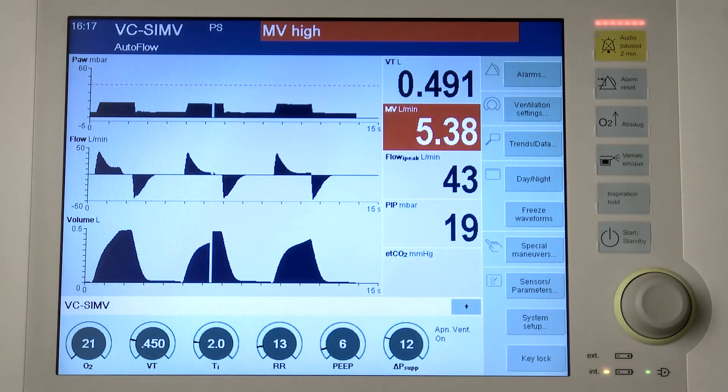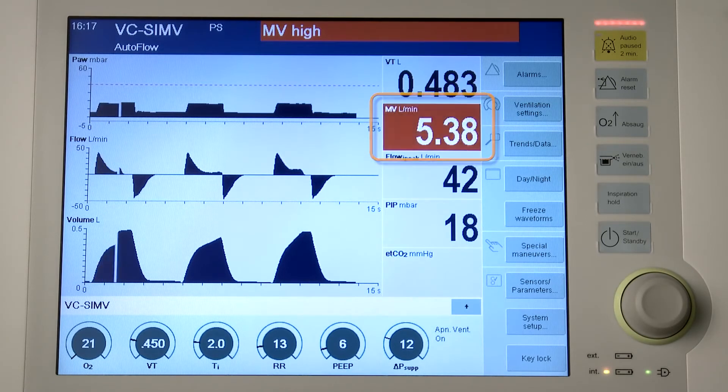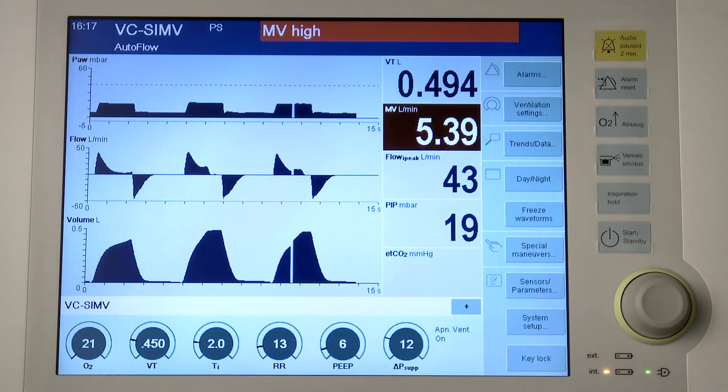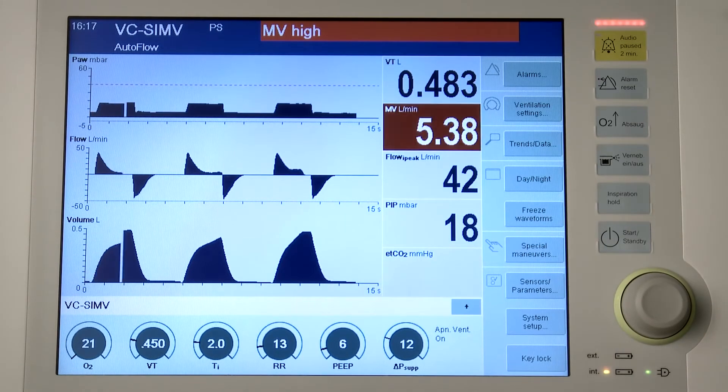Savina 300 displays the following visual and acoustic alarm signals. First, the system displays the relevant alarm message in the alarm message field of the header bar. Second, the parameter field of the parameter triggering the alarm flashes. Third, in the alarms dialog window, the corresponding measured value flashes. Fourth, for high priority or medium priority alarm messages, the corresponding LED flashes on the control panel. The background color of the alarm message field indicates the priority of the active alarm. If several alarms occur simultaneously, the alarm with the highest priority is displayed first.